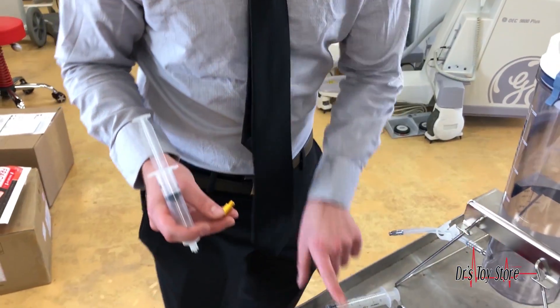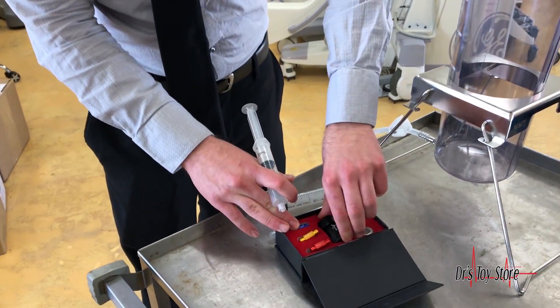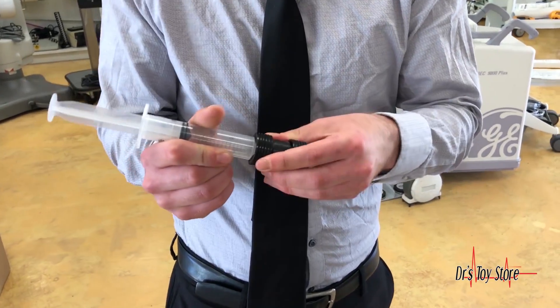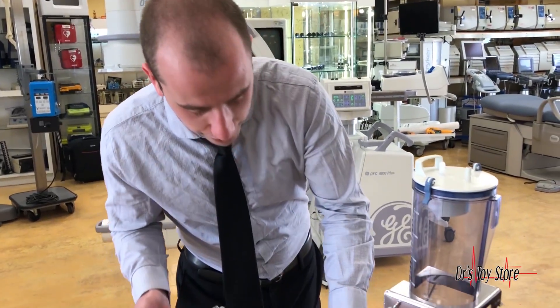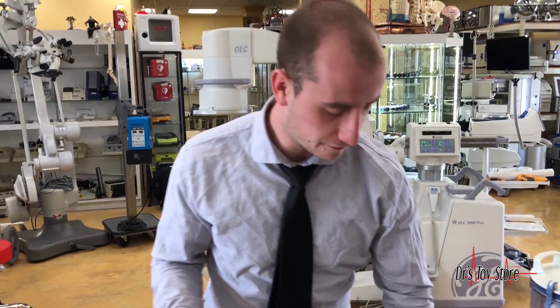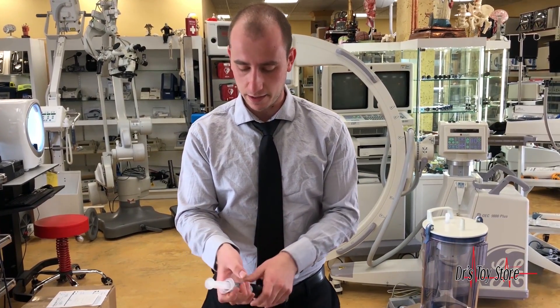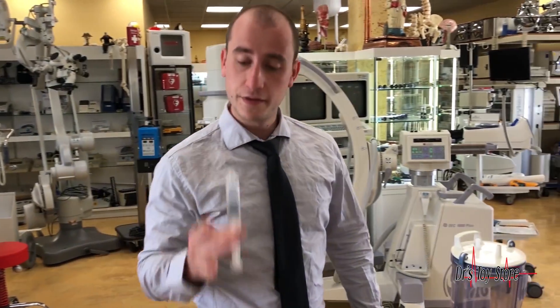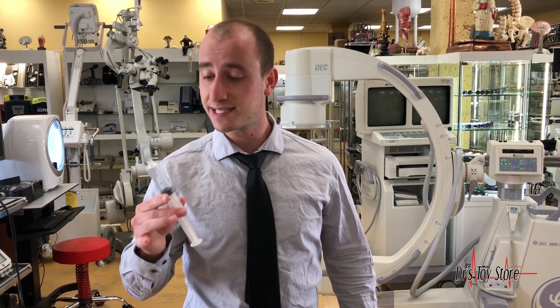So you start at 2.4, then 1.4, then 1.2 millimeter. Your final product goes through this strainer, and all the bigger fat cells are left over inside the strainer — you open it up, see the fat cells inside, and throw them out. This is all done after spinning it to get the blood out, and this will be your final product ready for fat reinjection.